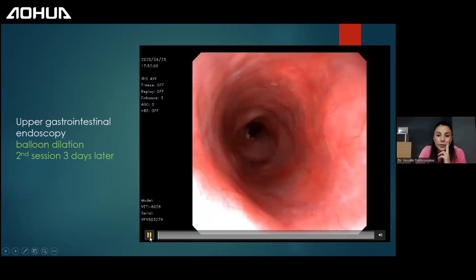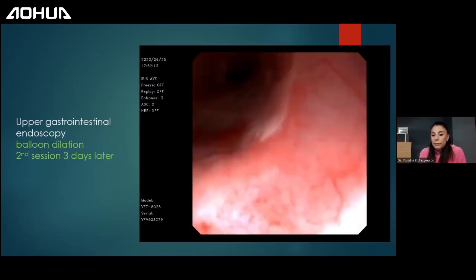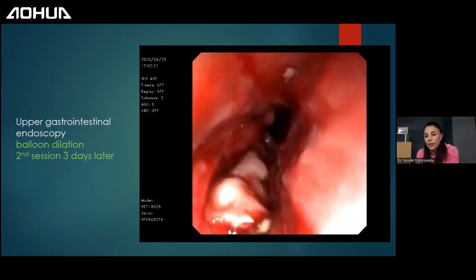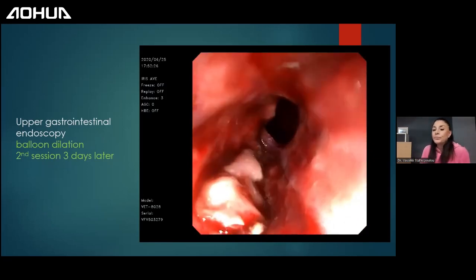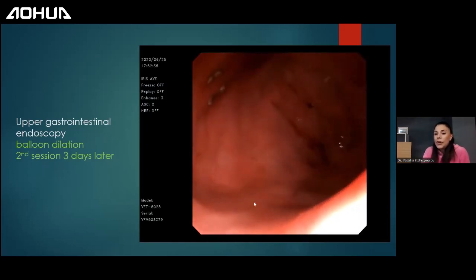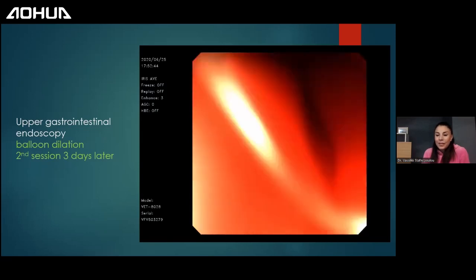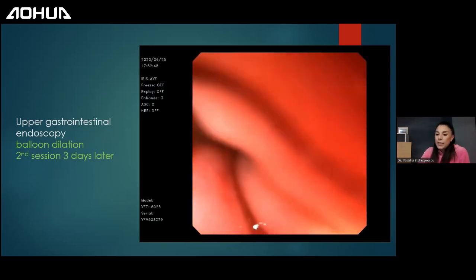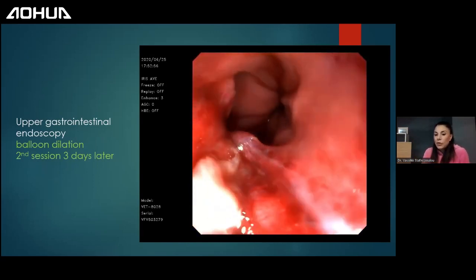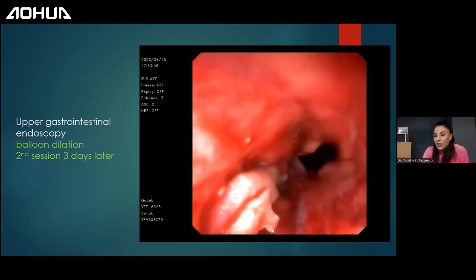And then 3 days later, the second balloon dilation, because I don't wait for more days, you see the damage. It has reformed. It has reformed not to the initial small size that it was, but it was a big stricture as well. So this time I went in more aggressively, as you see, and into the stomach. This is blood coming from the esophagus that's digested, okay? So don't worry. It's not gastric ulcers. And now what I'm doing is I'm going up and down with my scope, and I put a bigger diameter scope up and down in the stricture, okay, in order to dilate it even more. But you see that this time I was a bit more aggressive, and I caused more trauma to the esophagus.